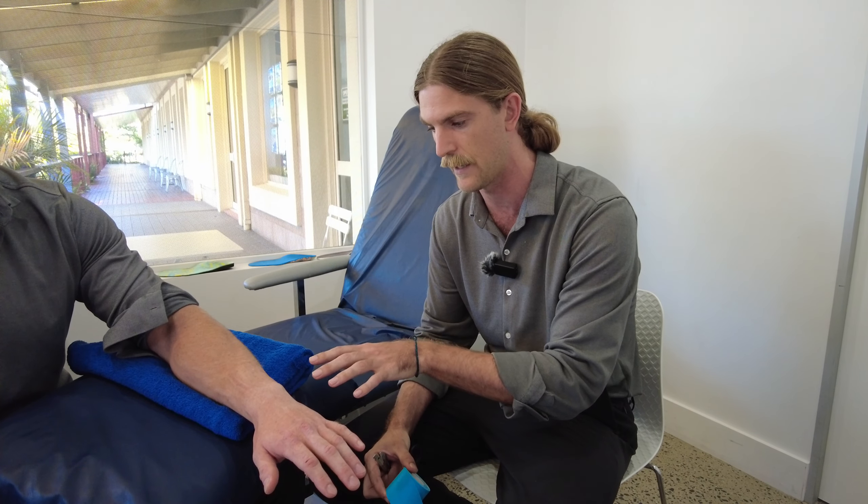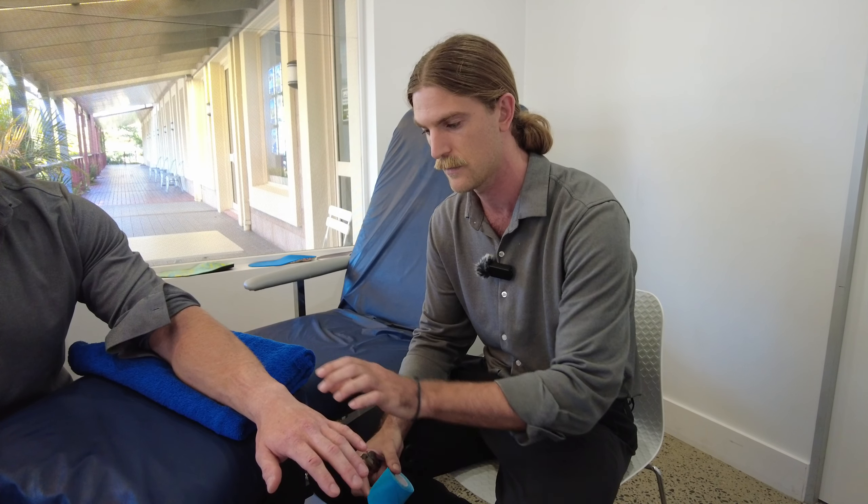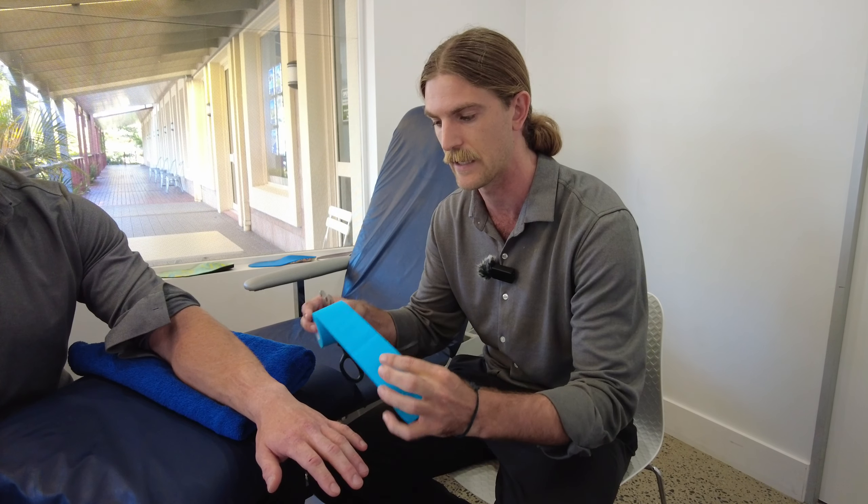We've got him lying down, nice and relaxed with his forearm on the pillow here, with that wrist off the edge so we can get access to apply the tape.